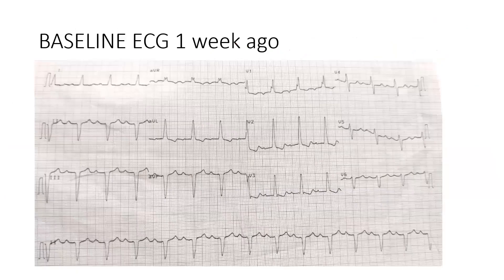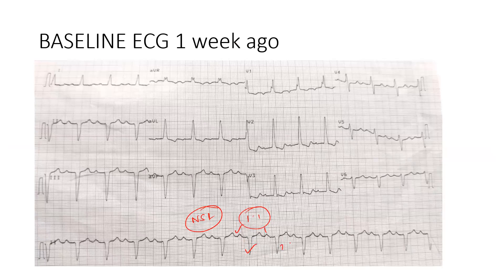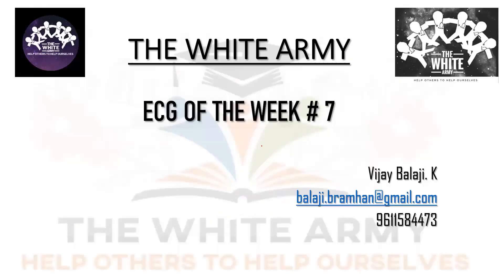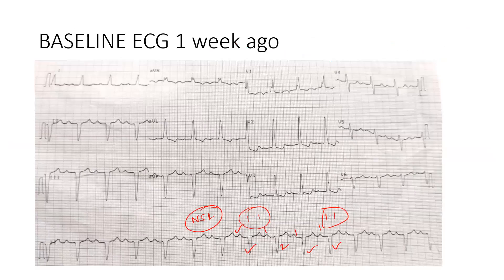Just one week back, the ECG showed similar findings, but it was a normal sinus rhythm — there was 1:1 AV conduction. But in this patient, in just one week, it has become 2:1. The importance is this: one week back, that ECG was already a predictor of impending complete block. Whenever we see this kind of pattern, the patient will deteriorate very soon.